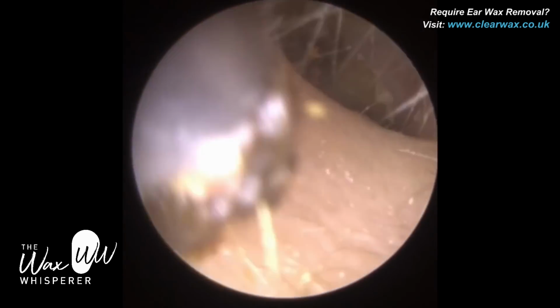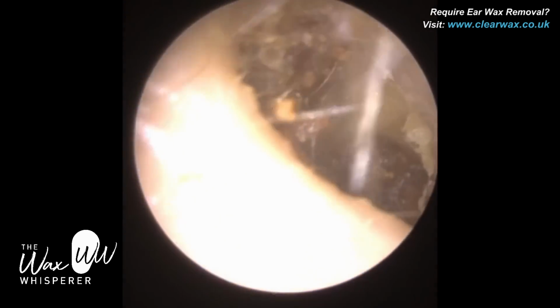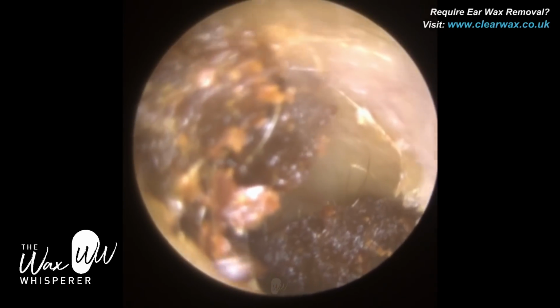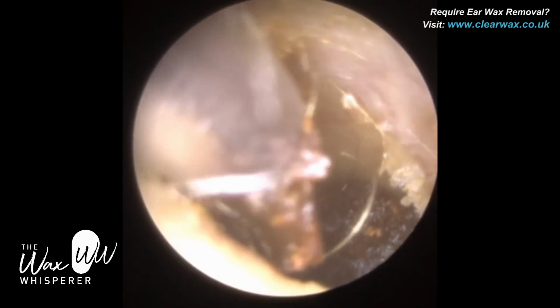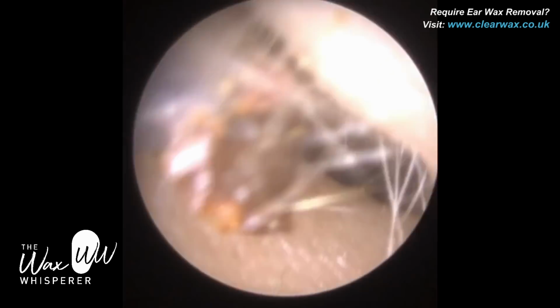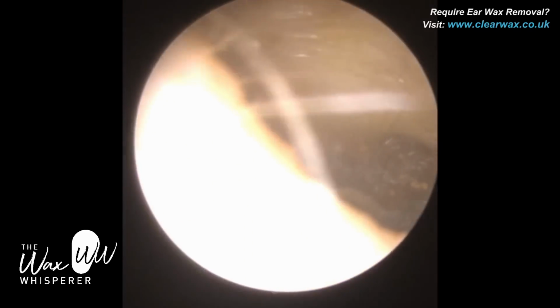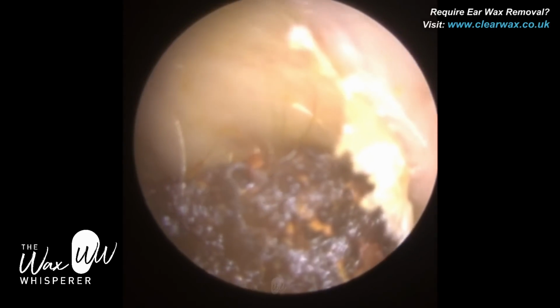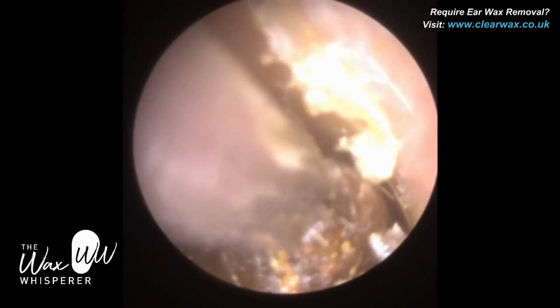The first bend of the ear canal is probably about half a centimetre into the ear canal itself, and it's cartilaginous, so it's semi-flexible. What we do is stretch the ear back and up to not only straighten the first bend so it's more in line with the second bend, which then makes the ear canal a straight cylindrical tube that goes all the way towards the eardrum, but we also can widen the ear canal by doing that.